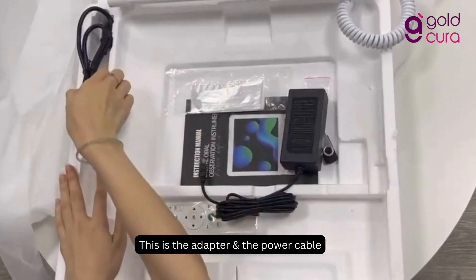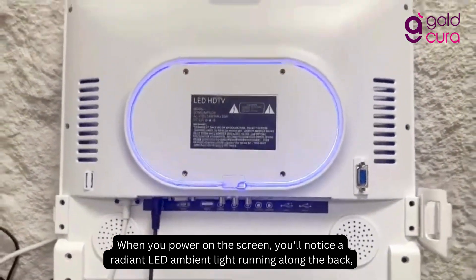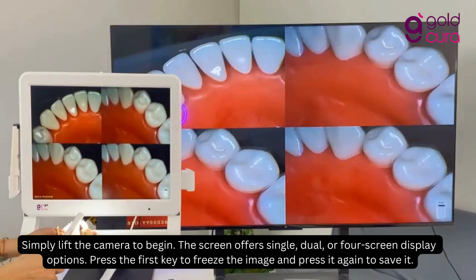This is the adapter and the power cable. When you power on the screen, you'll notice a radiant LED ambient light running along the back, enhancing the device's overall appearance and adding a stunning visual element to your setup.